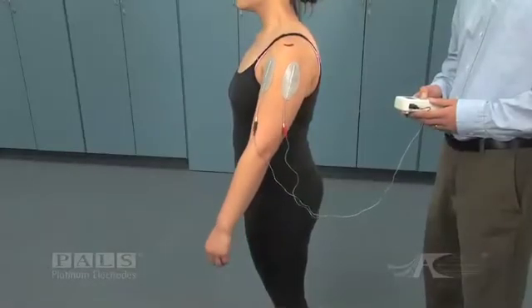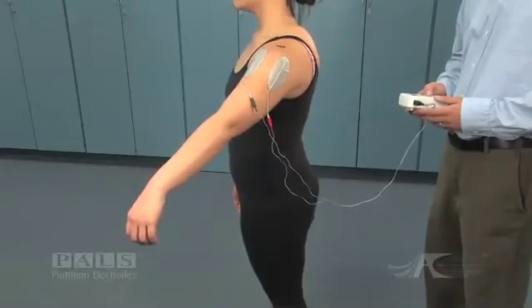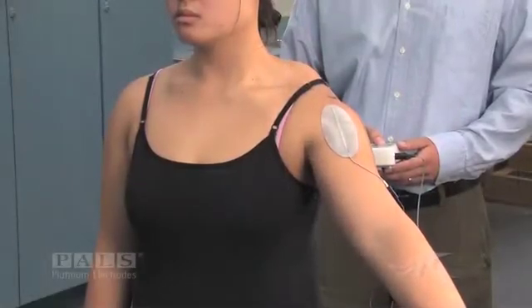In our first placement, the negative electrode of the asymmetric waveform is placed over the anterior deltoid, and you can see the resultant stimulation is one of dominant flexion.